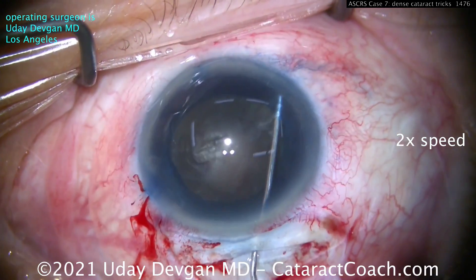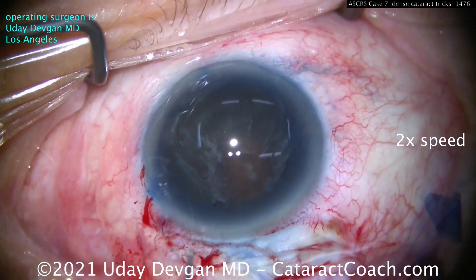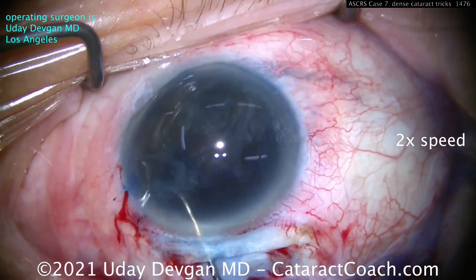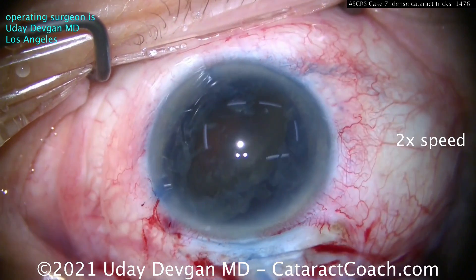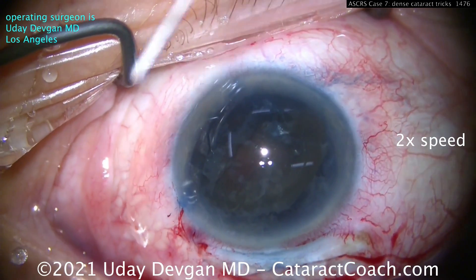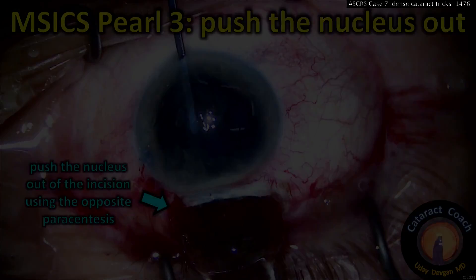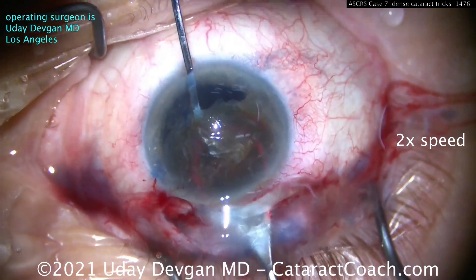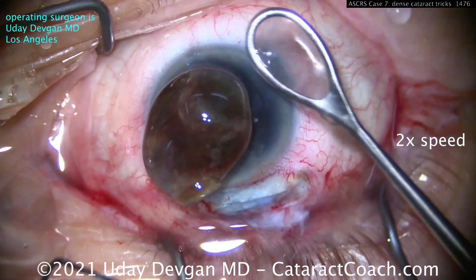You want the entire nucleus up out of the capsular bag. Use your chopper or whatever instrument to rotate it around to get it above the capsular bag and even above the iris. Put plenty of viscoelastic in the eye. Now, don't scrape the endothelium with the nucleus — so what we'll do is make an opposite paracentesis, then open that up to the full trapezoidal shape of the incision, and push the nucleus out through the other side using the lens loop. We're staying away from the endothelium. Look how dense that nucleus is — pushing it out of the eye with a good push, and there it is. No scraping of the endothelium at all.